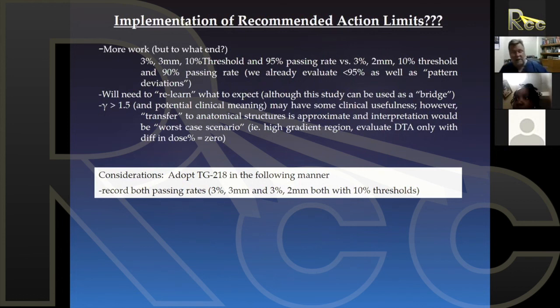So that's how we're trying to learn what this decreased criteria means, especially when for 150 patients, we did not find any clinical correlation with those failures. They do find big errors, as you saw with respect to the two examples that we've given, but none of the small ones like this would have caused us issues with patients. So we're still learning as everyone else.